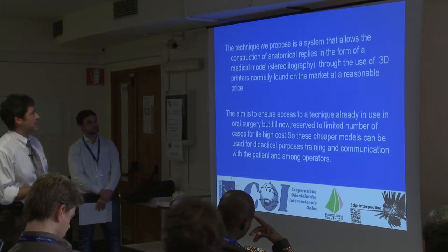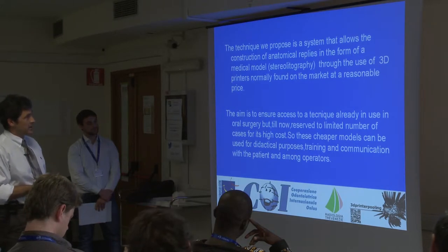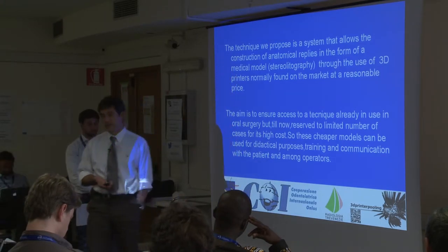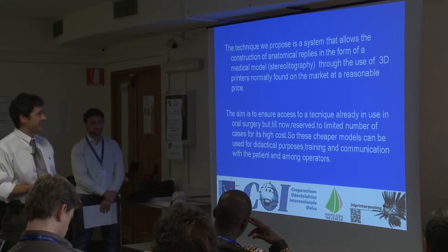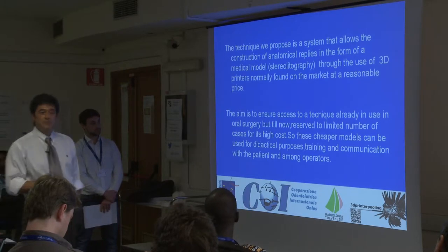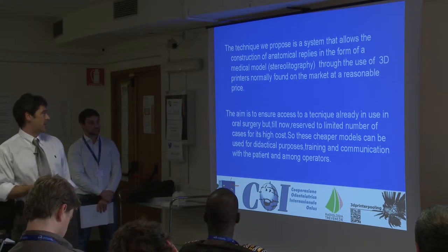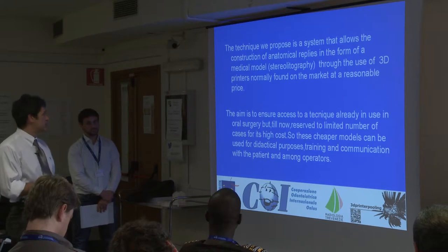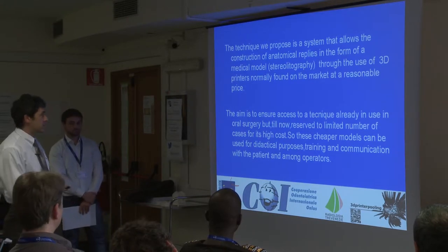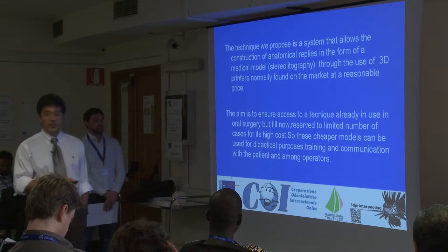So the technique we propose today is a system that allows us the construction of anatomical replicas in the form of a medical model through the use of 3D printers normally found on the market at a reasonable price. The colleague before me shows some very beautiful realization, but with professional 3D printers, which are very, very expensive. We usually use them in oral surgery, for example, but it costs really very much for us. So the aim is to ensure access to a technique already in use in oral surgery, but till now reserved to limited numbers of cases for its high cost. So these cheaper models can be used for didactical purposes, for the training and the communication with the patient, and also among operators.